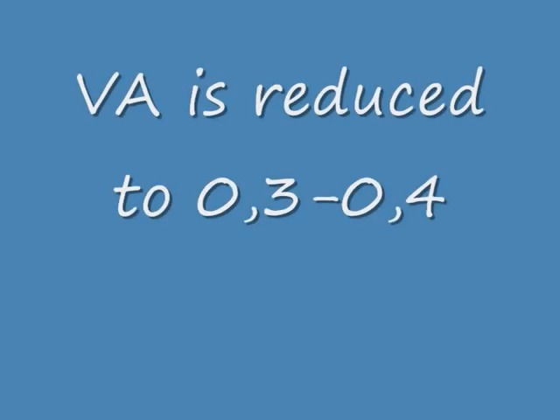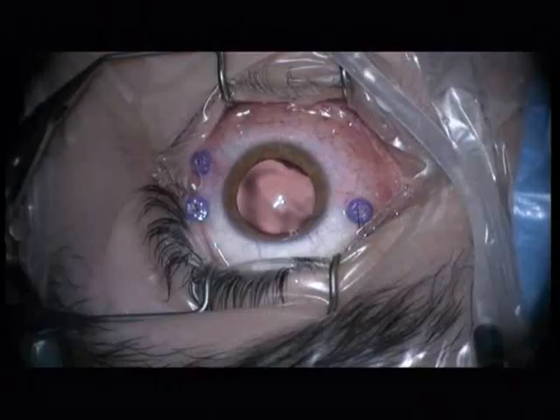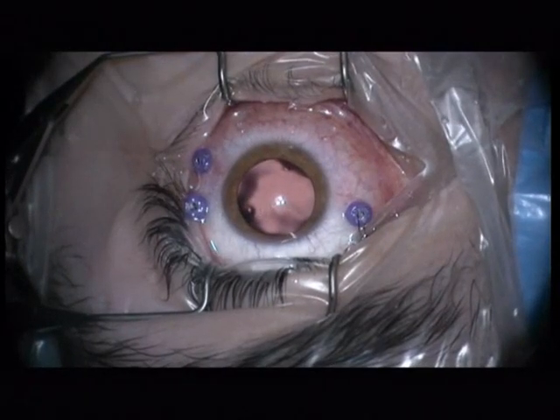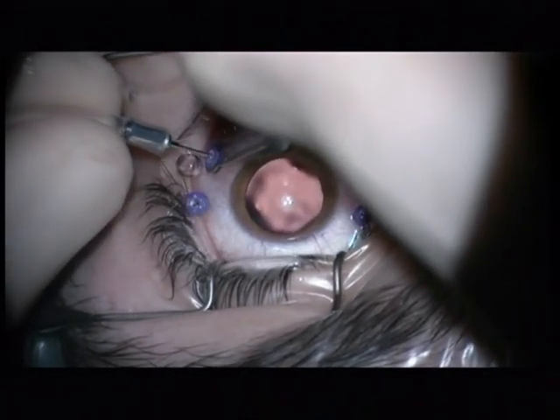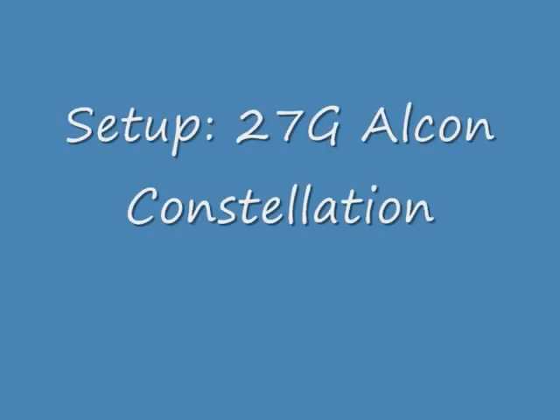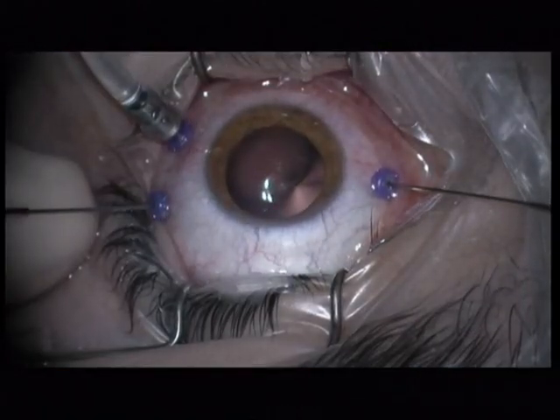You can see that the visual acuity reduced and that there is a pronounced membrane, idiopathic, at the superior arcade. I will perform a 27-gauge vitrectomy, lens-sparing of course, with Alcon Constellation.